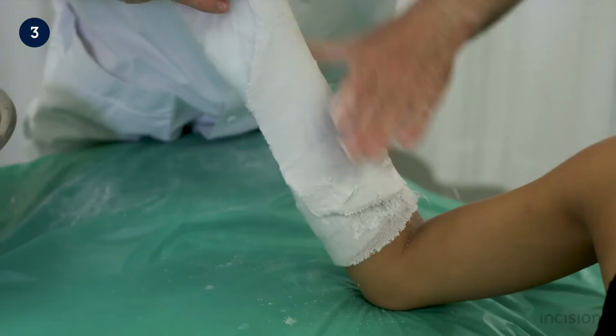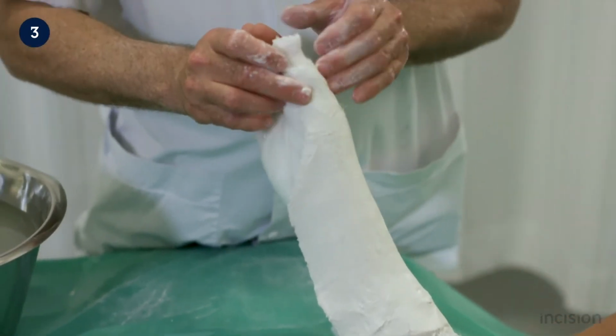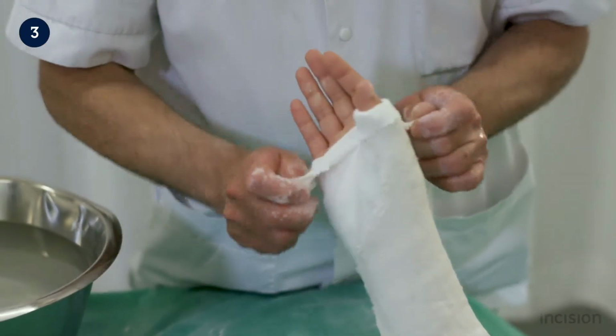Care should be taken to not place the plaster over the skin, as this may irritate the skin and even cause thermal injuries. The remaining stockinette and padding are folded back to create smooth edges.